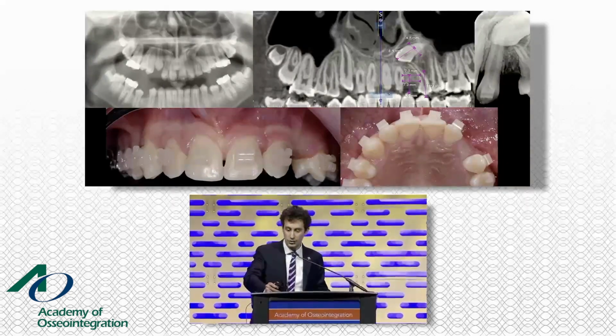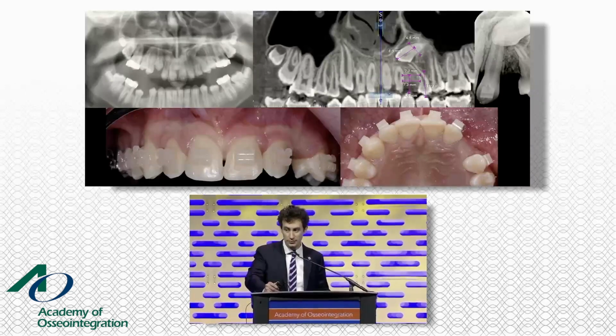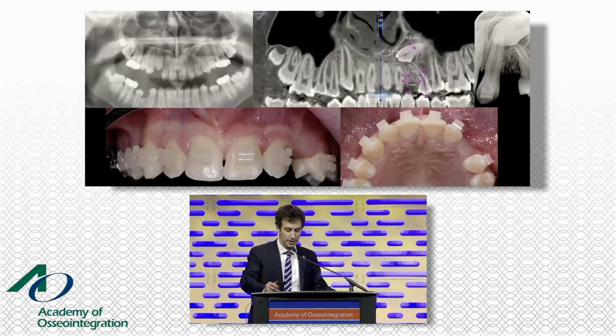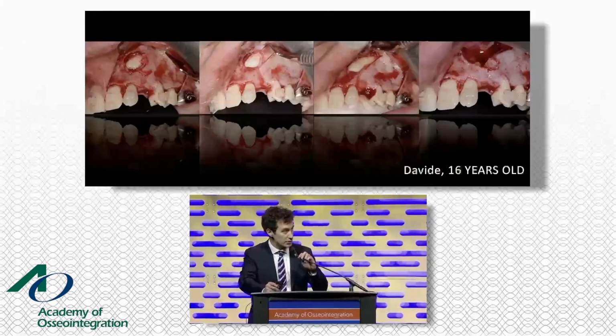So the orthodontist, after careful consideration, sent us the patient for the extraction of the cuspid because he considered it impossible to treat this cuspid with traditional orthodontic treatment. So in accordance with the orthodontist, we decided to try an autotransplantation to maintain the tooth. And now I'm showing the procedure.